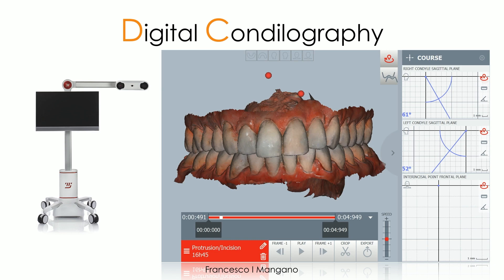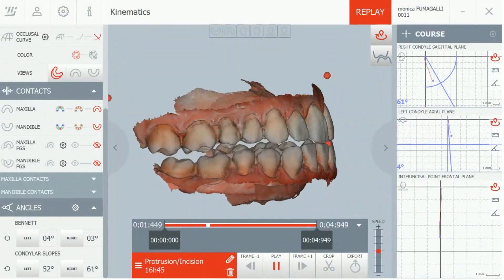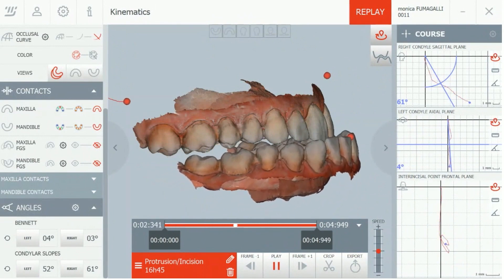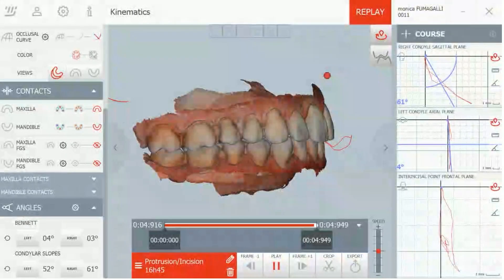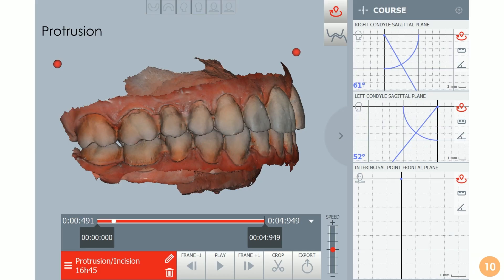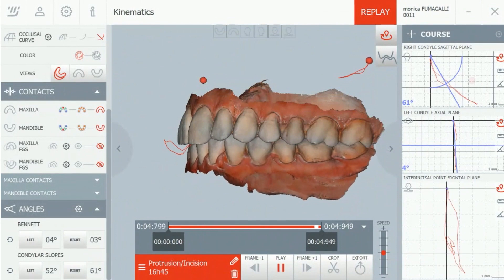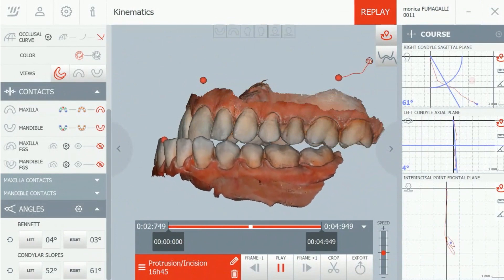As you can see here, this is how it works. Basically, the device works like a motion tracking system, and we can have a real-time registration of the movement of the patient. In this case, from the maximum intercuspation where the patient is protruding — so the protrusion is one of the first movements we register. We have all the set of information needed, 2D and 3D. The visualization tool is very valid because it can give us an idea of the movement in 3D, and that is quite important. This is the protrusion again — the first movement we capture.